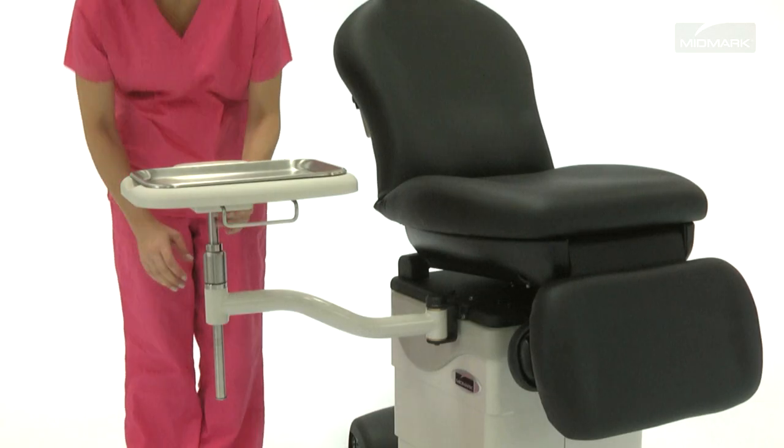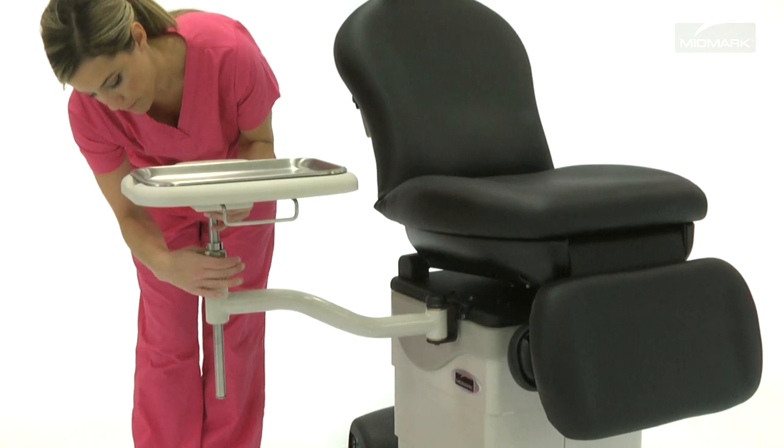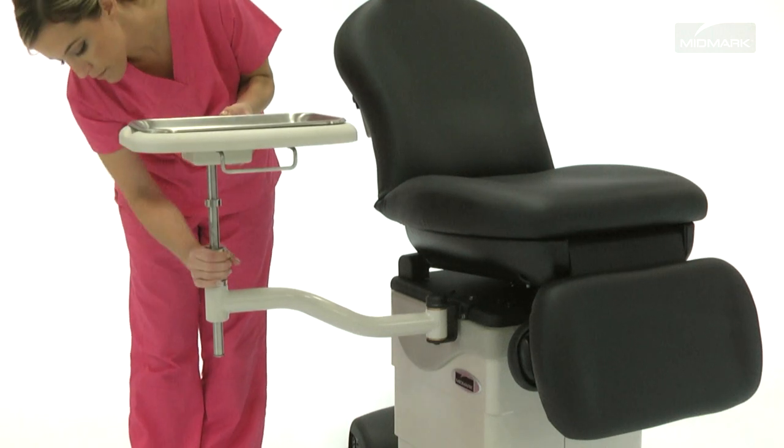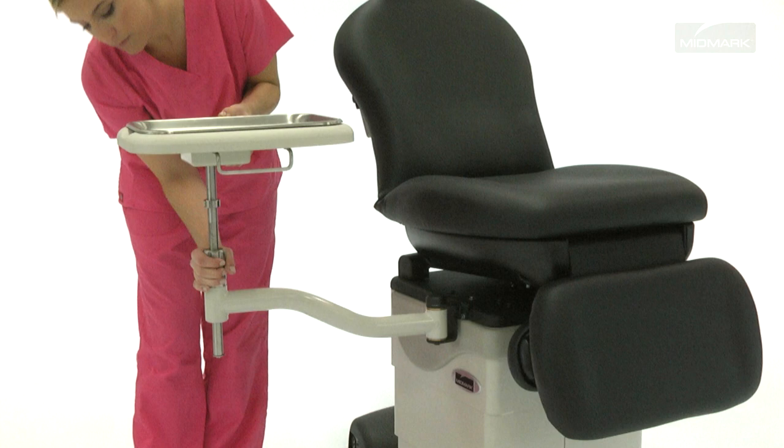The fixed-top swingarm instrument tray is height-adjustable. Simply loosen the adjustment knob, raise the tray to the desired height, and tighten the adjustment knob to secure into place.